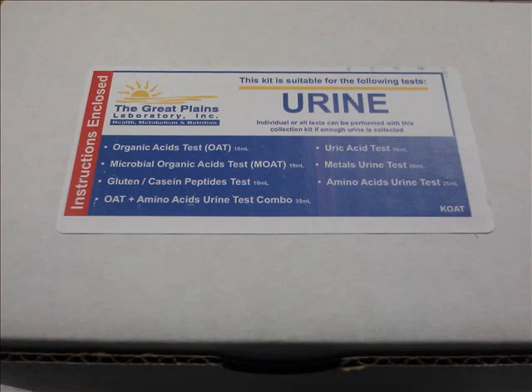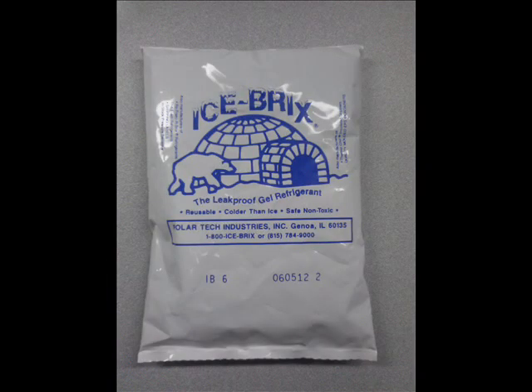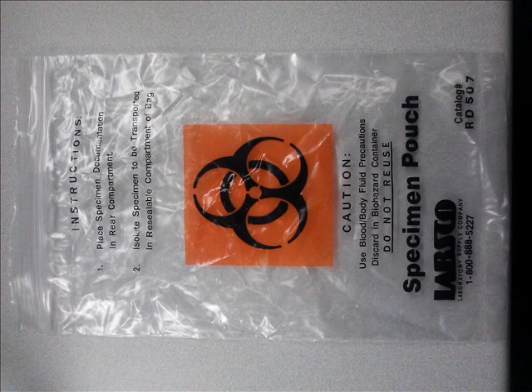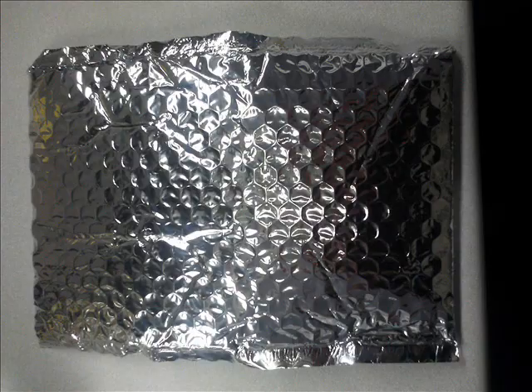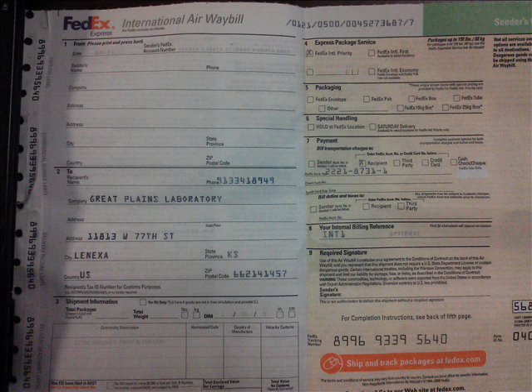You should find the following items inside the box: one plastic urine cup, one freezer ice brick, one Ziploc specimen pouch, one silver U-line envelope, one white absorbent square, one FedEx clinical pack, one stapled test requisition packet, and one pre-printed FedEx international airway bill.